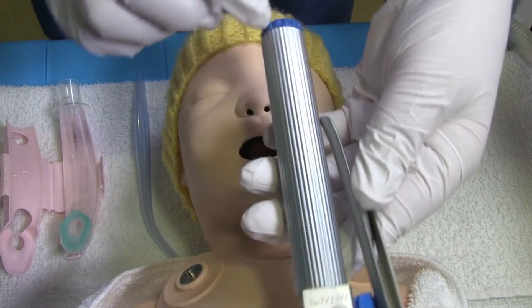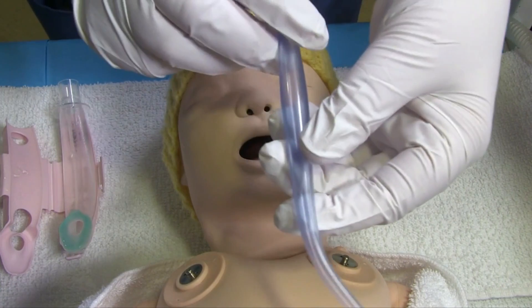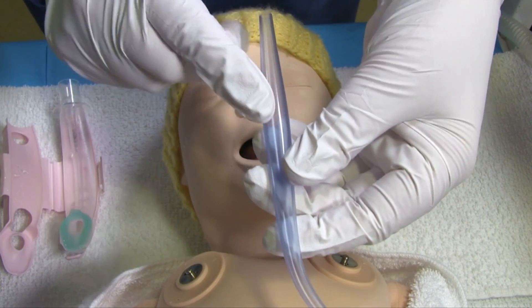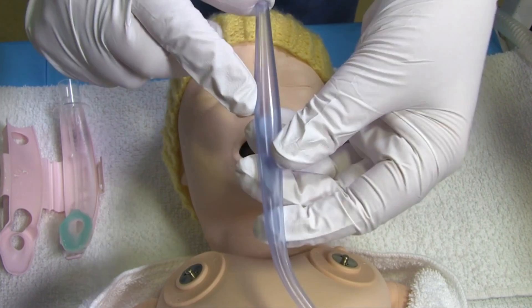For insertion you will need a laryngoscope — that's to control the tongue — and you may want to have a large bore suction catheter or a Yankauer sucker available to remove any particulate that is in the back of the oropharynx, for example meconium or bloody clot.